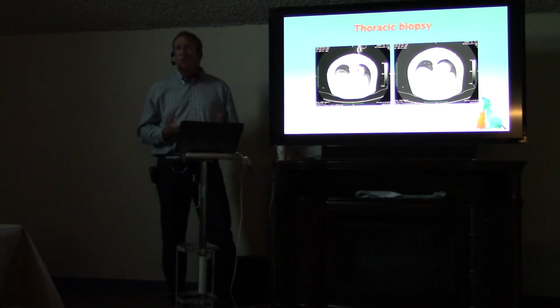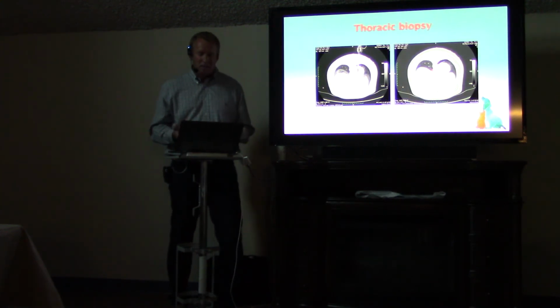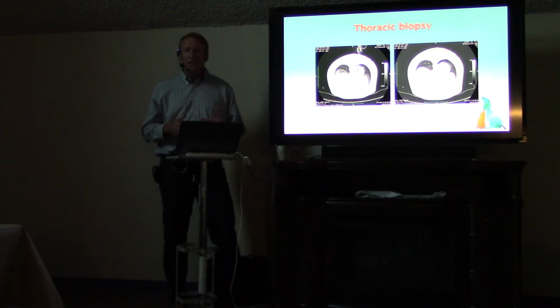A mild amount of pneumothorax is not uncommon, and we see that here following the biopsy procedure. I've done quite a few of these studies or these techniques, and I've only had a couple cases where the patient actually had to be tapped to remove the pneumothorax. I've never had a life-threatening complication. So even though we are going through some normal lung, there are risks associated with it, but sometimes getting a diagnosis is worth that risk.